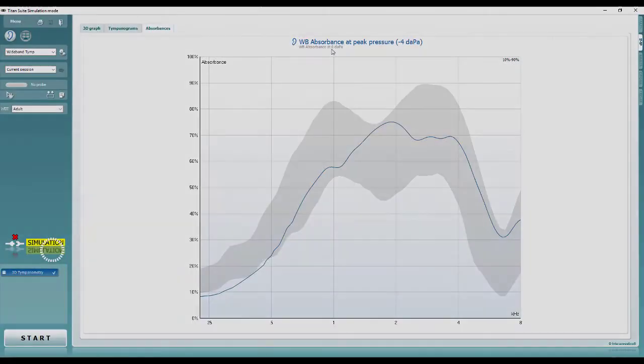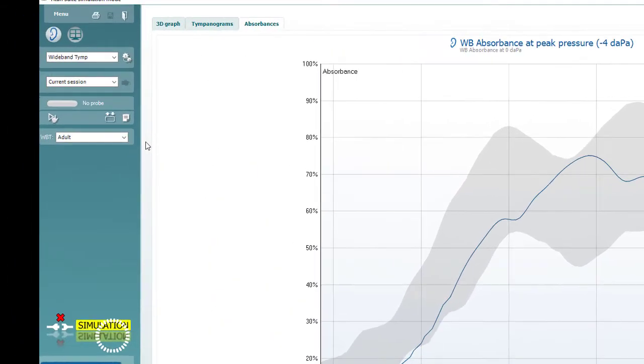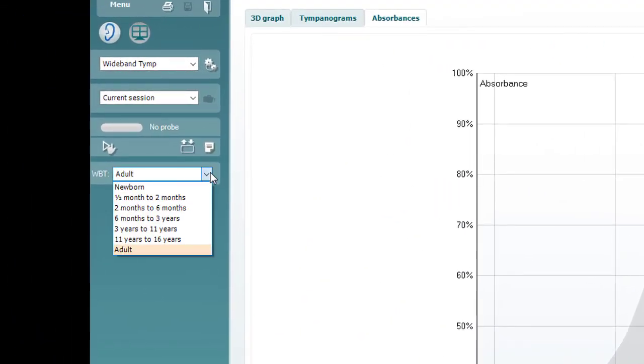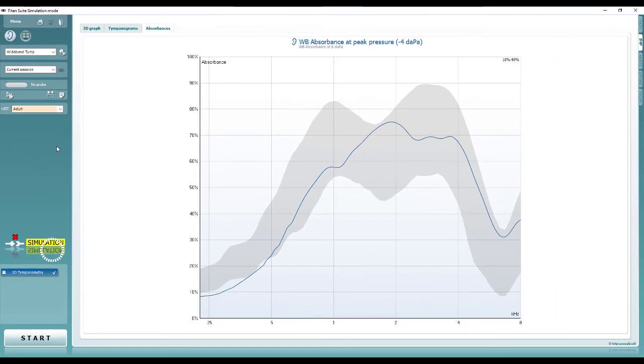Normative data is provided for absorbance values for different ages, as well as for the wideband average tympanogram. So it's important the correct age group is selected for your test subject. This will be selected by default if the Titan suite is run through a database.